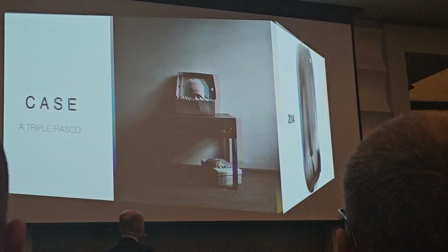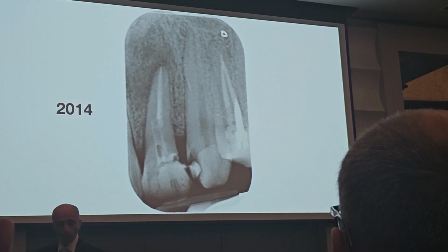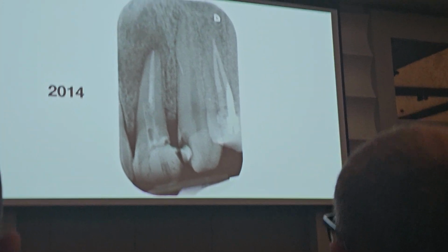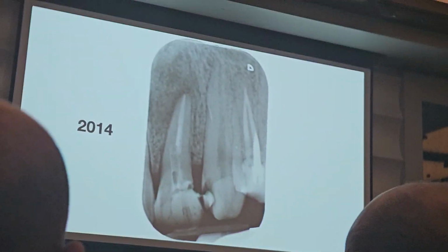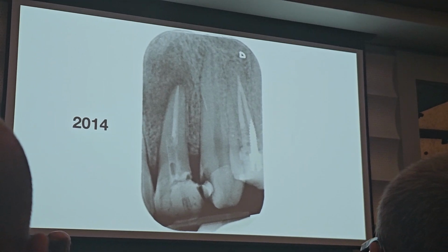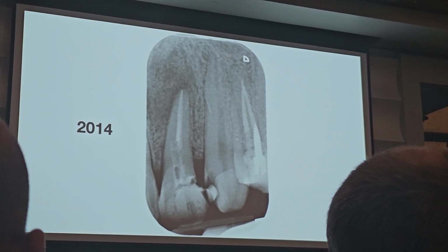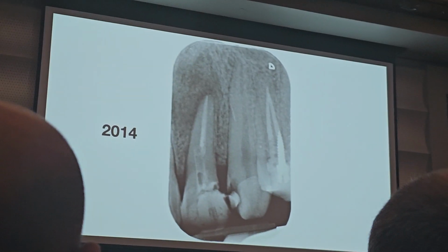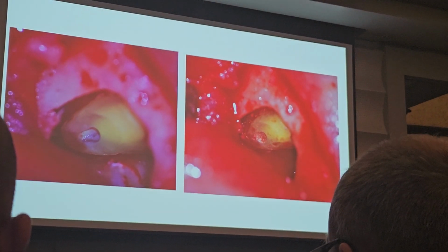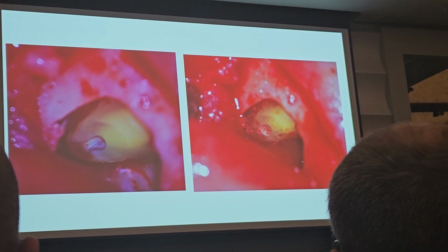So let's move to the triple fiasco. Look at this case. The patient came to my attention owing to an abscess. Sometimes with these root canal treatments for these central incisors, there is a fiber post. I should suspect a fracture. I diagnosed a periapical problem. So I did an apical surgery. Again, with my microscope, I was very powerful with the video.